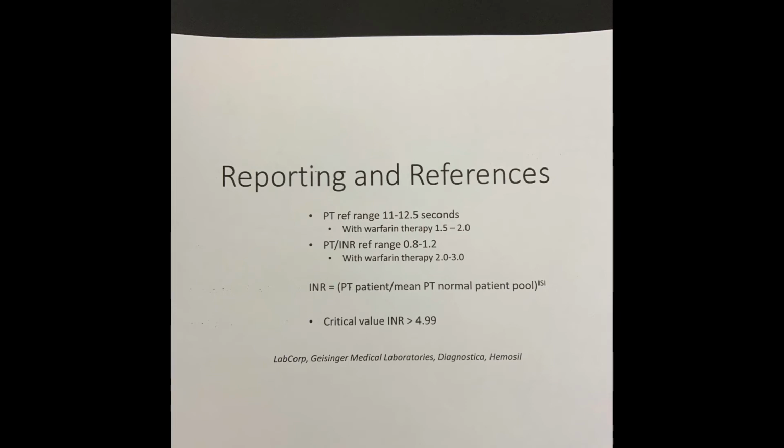Patients have been unfortunately lost because this calculation wasn't performed correctly. And it's important to know that there is a critical value for your INR, and if you achieve a level of 4.99 or greater, you are at risk of bleeding and your medical care needs to be addressed.